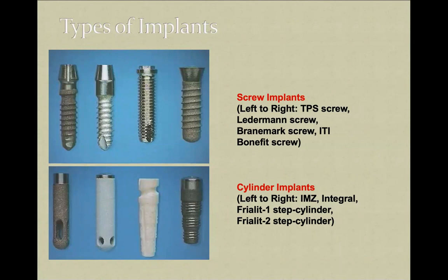It's really easy for the surgeon to place this kind of implant into a narrow alveolar ridge. You should not do any bone grafting, any bone splitting. You just drill and place the implant, and that's it. But you should think about the future. You should think about your prosthodontic rehabilitation.